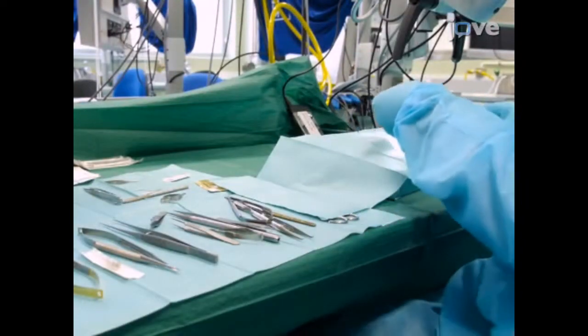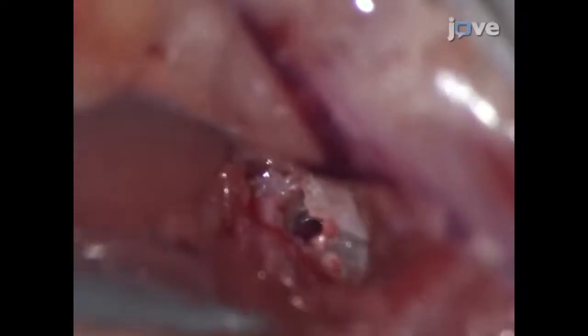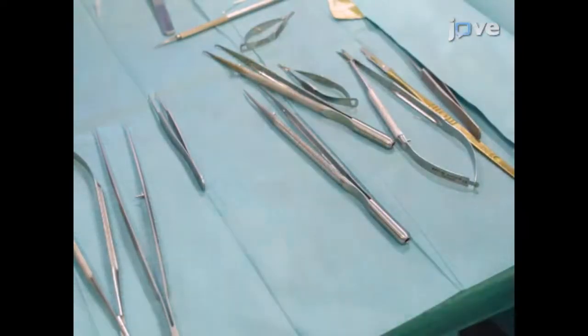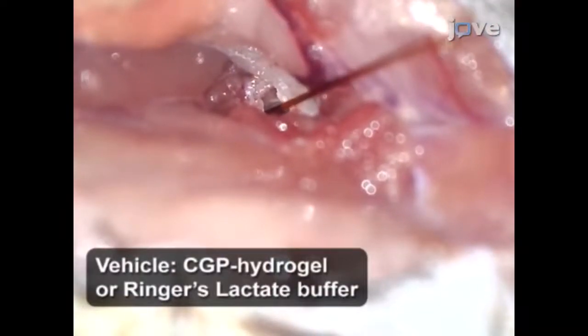Then, use a 27-gauge needle to drill into the bulla and create an opening. Clean the blood from the drilled area with an absorbable gelatin sponge. Locate the stapedial artery and the round window membrane caudal to it. Using a 34-gauge catheter and a glass microsyringe, slowly inject 3 to 5 microliters of vehicle solution through the bulostomy and directly onto the round window niche to fill it.